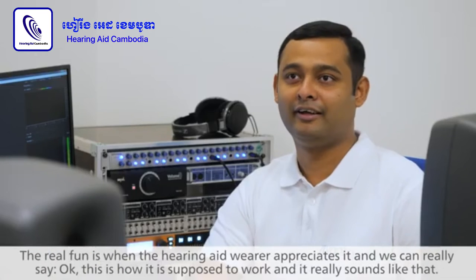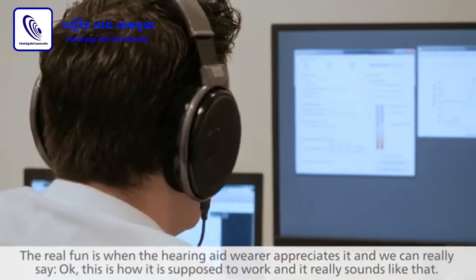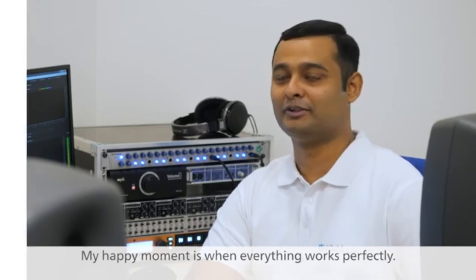The real fun is when the hearing aid bearer appreciates it and when we can say, okay, this is how it's supposed to work and it really sounds like that. The moment of joy is when it works perfectly.